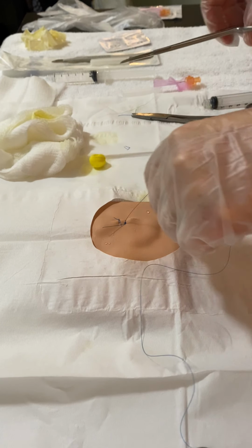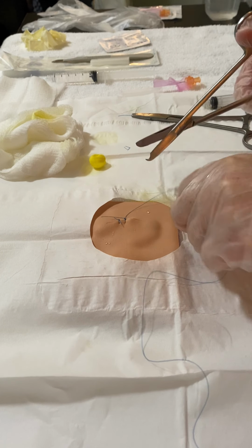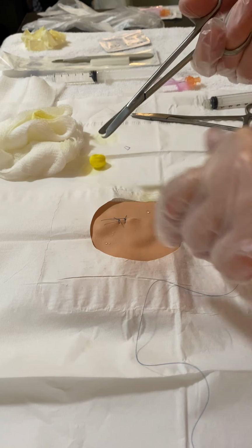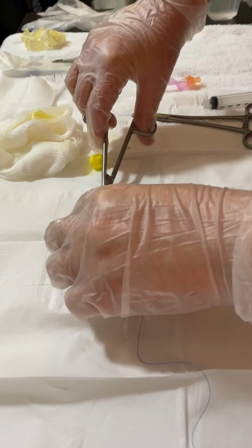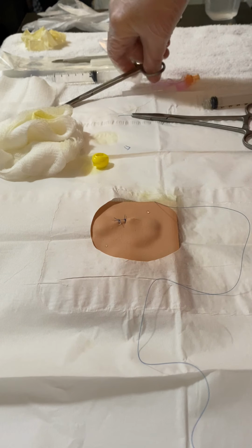So then from there, you could go in. And of course, this procedure is sterile, so touching here at the suture material, we would be covered.